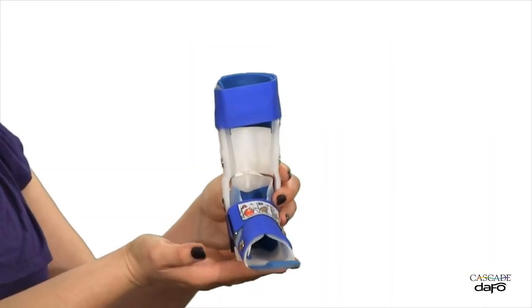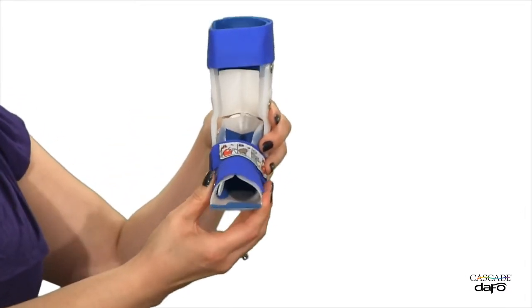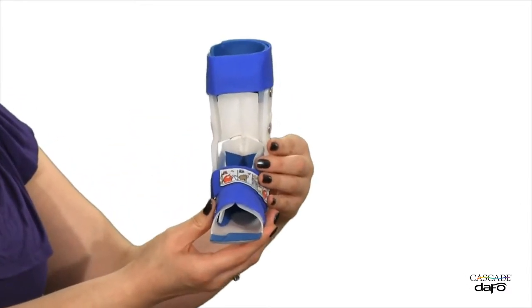Hi, I'm Brianna. I'm here to talk about one of our custom-fabricated AFOs, the DAFO-2. The DAFO-2 features defined plantar surface contours and a full wraparound shelf for flexible control of foot position and alignment.